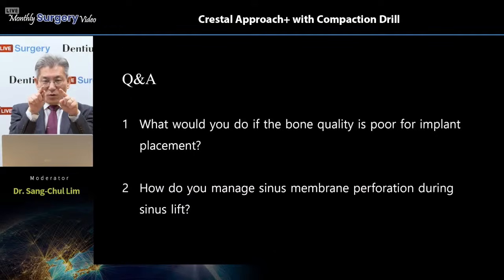If it looks like a small lateral window, we should make it wider and wider. Nowadays, actually, wider horizontally, because the upper part is a dangerous zone, as you know, with the arteries running there, and it is a little bit difficult to access. So nowadays a little bit wide trench style window is better. And after that, detach from this intact area.